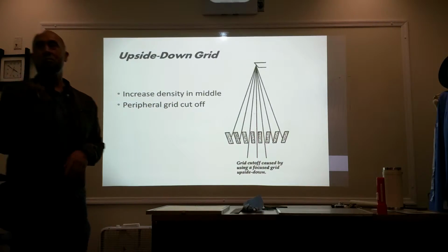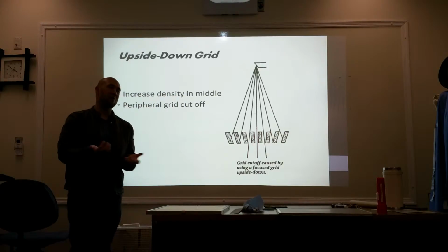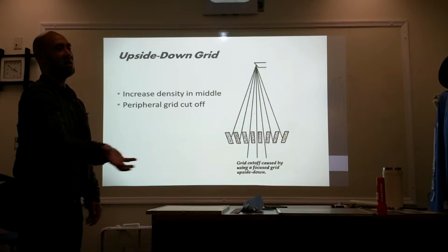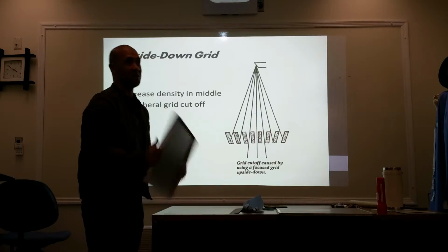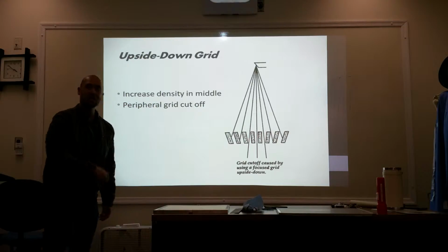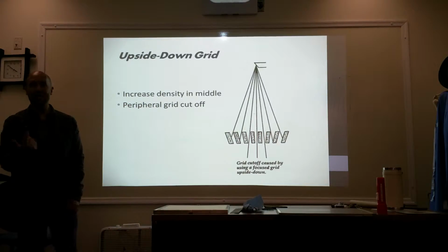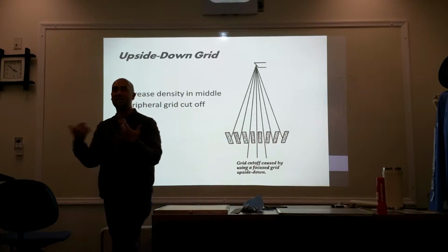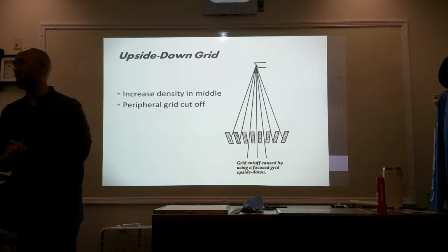Upside down grid, you're working so fast, okay? You just had a bad day at work, you're not thinking straight, you haven't had lunch yet. You're gonna go shoot your portable, you put your grid underneath, but you're not paying attention to whether it's upside down or right side up. Okay? Are you still gonna get an image? You're still gonna get an image, but you're gonna have grid cutoff or decrease in density on the periphery of your image.